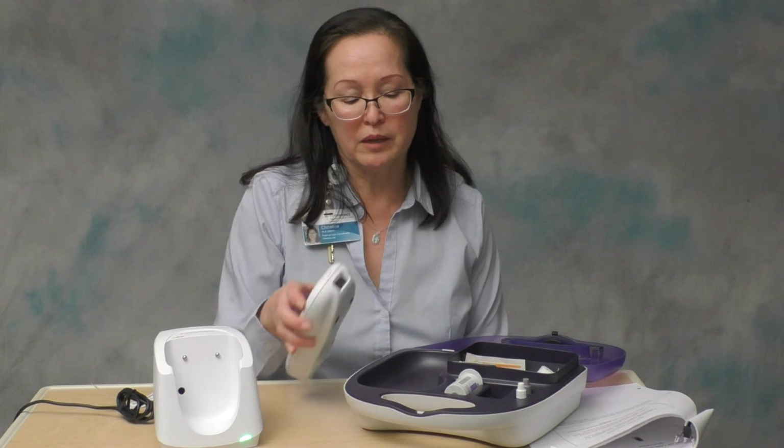All right, so moving on to patient testing, the first consideration that we make is whether or not it's appropriate to do finger stick testing on your patient. In our facility, we have one restriction against finger stick testing, and that is that patients who have impaired peripheral circulation should not have finger stick testing done. We feel that it may be difficult to reach the capillary bed, and also that the capillary blood is not going to be very representative of the peripheral circulation. So don't perform finger stick testing or capillary testing on patients with impaired peripheral circulation.